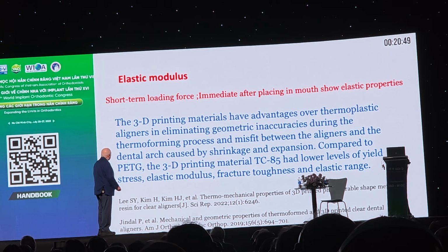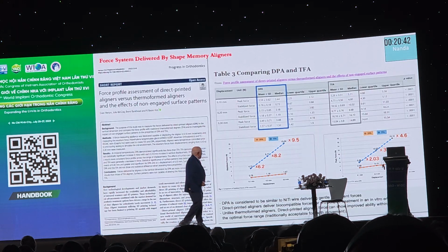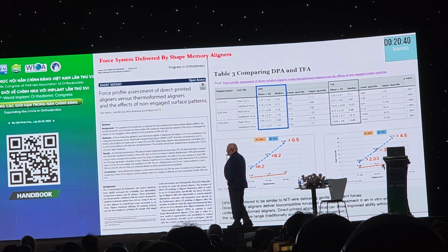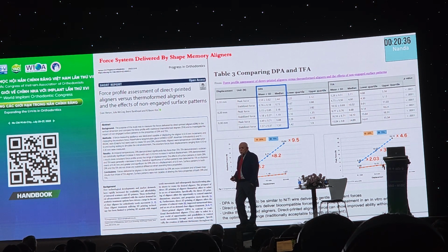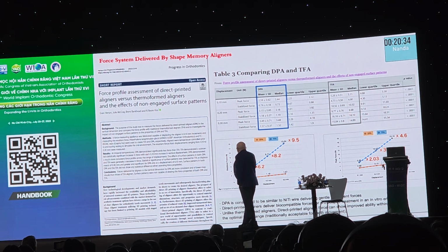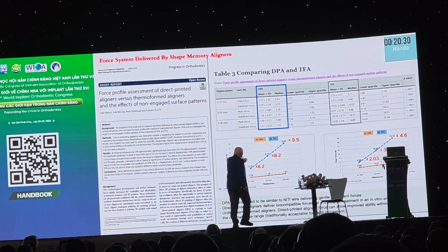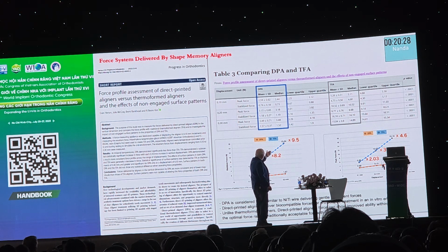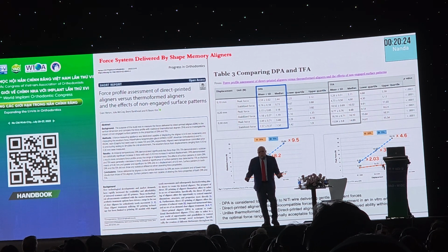This is another short-term loading force, immediate placing. What happens with elastic modulus? I'm just going to show you this. I think he's going to talk about these studies in more detail, about how much force difference there is. Take a look at it. Here you have 15 newtons versus 1.5. The force values are very little.